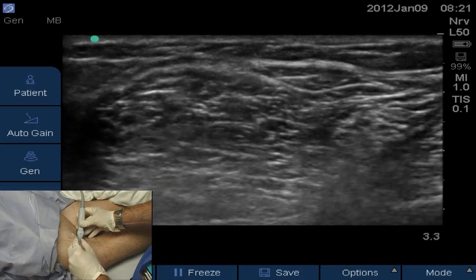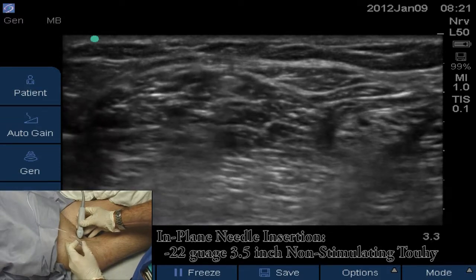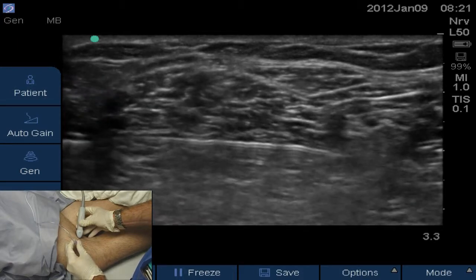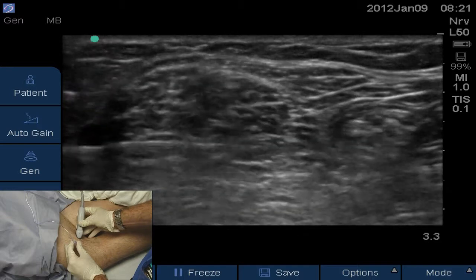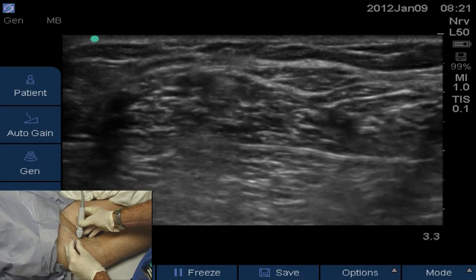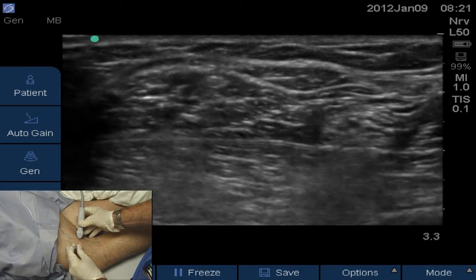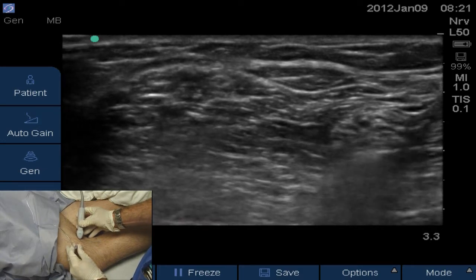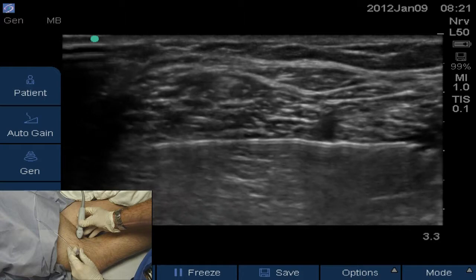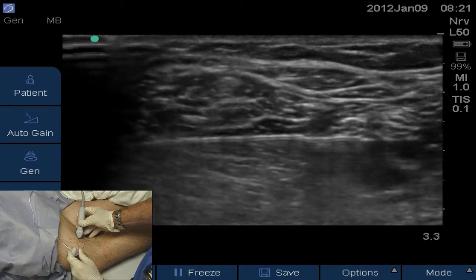A lot of pressure. That same track we just took with the finer needle — we're going to target the 6 o'clock position relative to the nerves, which are currently together. Peroneal and tibial nerve are together, and by the time we get done injecting — make a mental note of how they look now — we ought to have them separated. I'll pop in just below, go just under and a little past. That's where I'll make my first injection of 5cc's — aspirate and get 5cc's there. Plunge so the air stays out. See it tracking along the medial side of the nerve. Pulling back a little to about 6 or 7 o'clock — you doing okay?